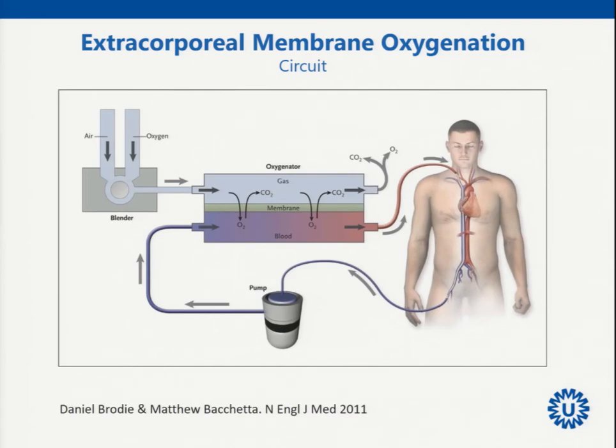So then you understand that the CO2 removal part of extracorporeal membrane oxygenation depends on gas flow, but the oxygenation of the patient primarily depends on blood flow.